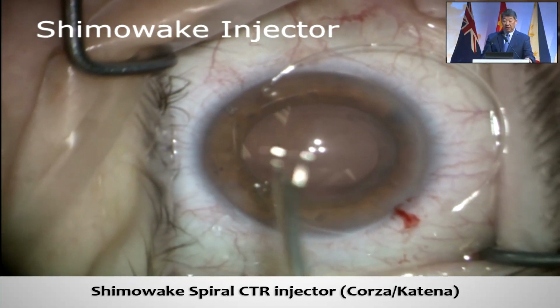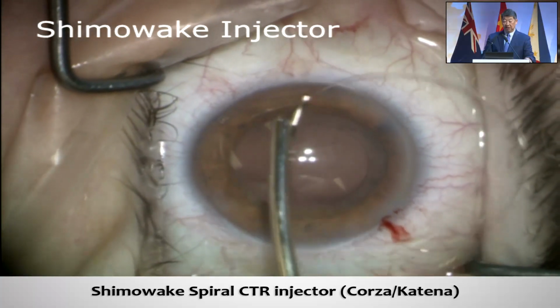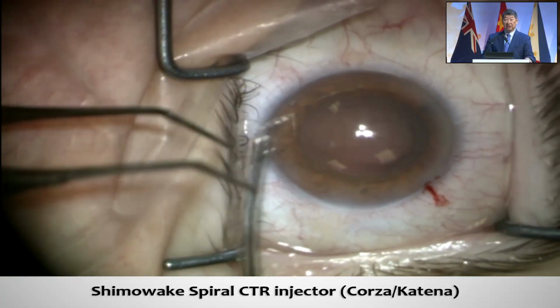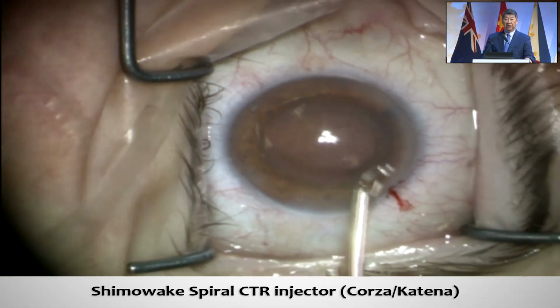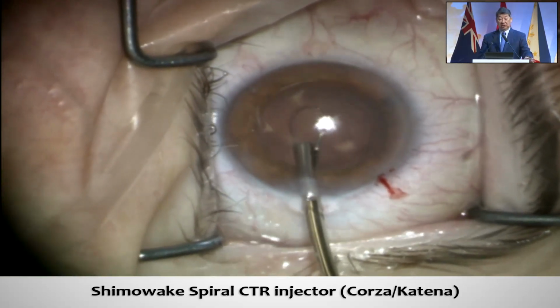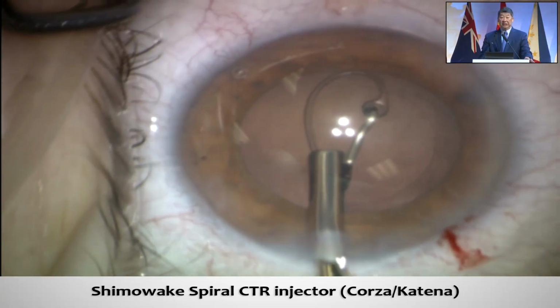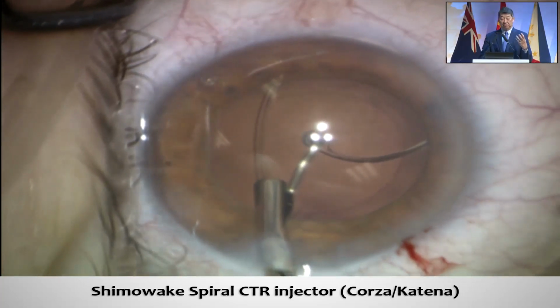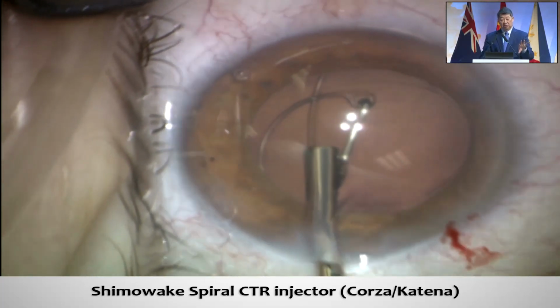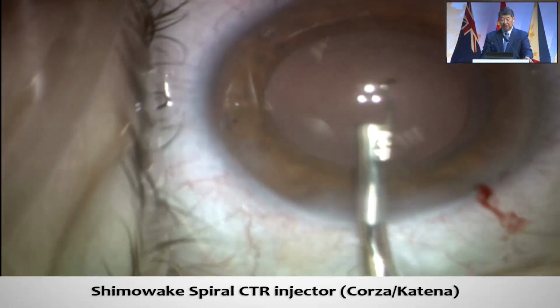So this is a great innovation from Dr. Shimawaki of Japan. The one hook retracts the one eyelet, and the fixed little hook bends the lead eyelet. So now when I go in, instead of having the capsular bag and the zonules being what bends the CTR, it bends automatically. All that tension in the CTR is borne by that fixed hook rather than by the capsular bag. And then you just tilt it a little bit and it will drop in there. You can see it's available through Corza and Katena. Great invention by Dr.